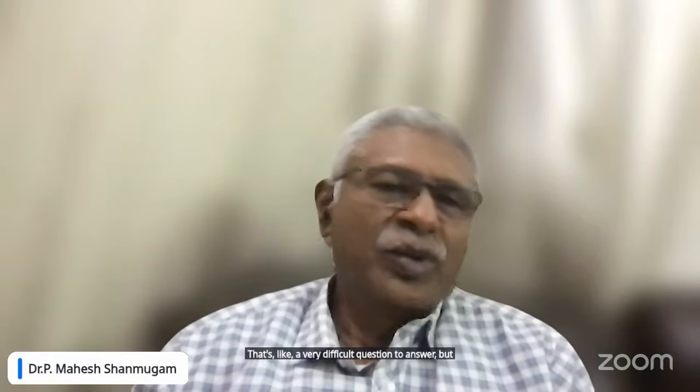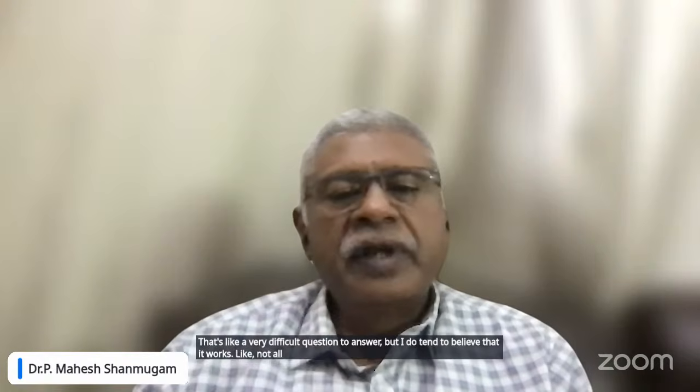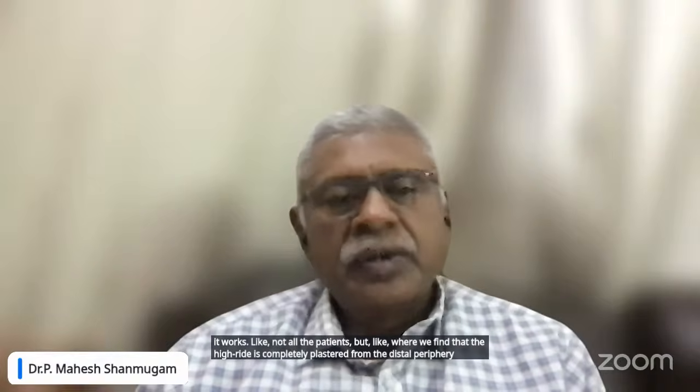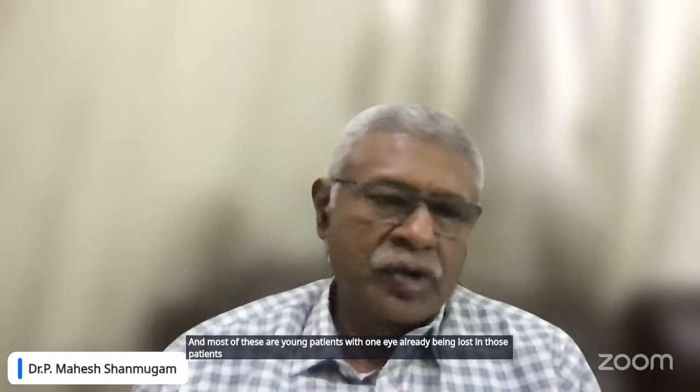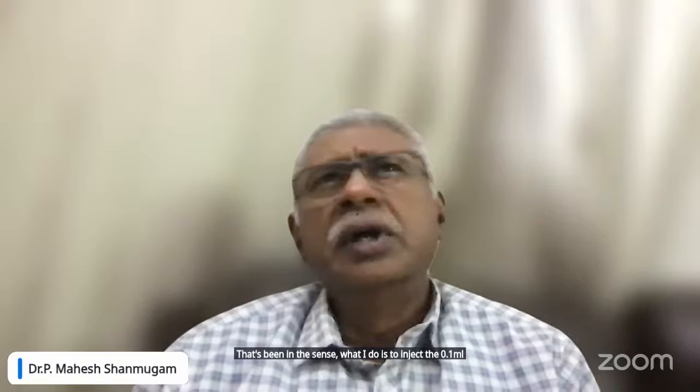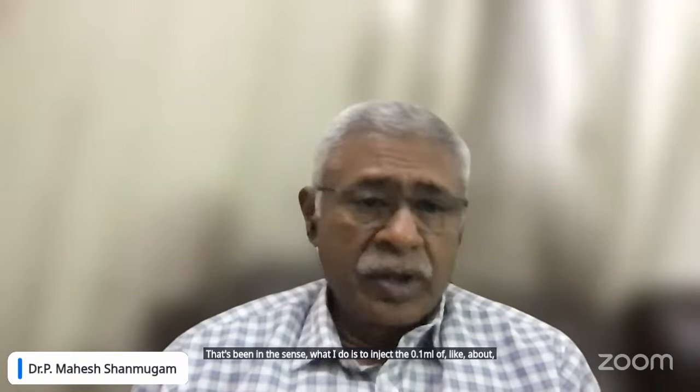It's a very difficult question to answer, but I do tend to believe that it works. Not in all the patients, but where we find that the hyaloid is completely plastered from the disc to the periphery, and most of these are young patients with one eye already lost. In those patients, I give everything possible. With plasmin, what I do is inject 0.1 ml of about 25 to 30 micrograms of TPA, 0.1 ml of autologous blood, and anti-VEGF. All these three are injected about 2 days prior to the surgery. It's not on the same day, but 2 days prior to the surgery.